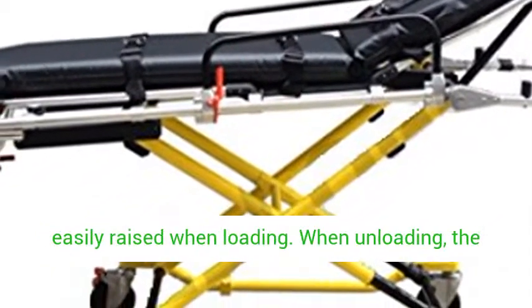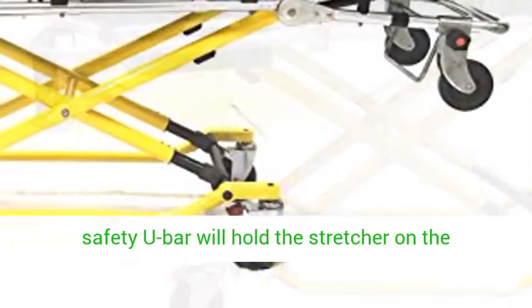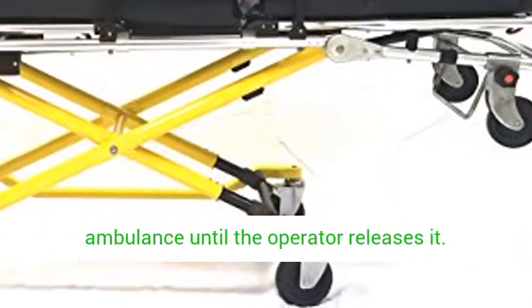The X-Frame undercarriage is easily raised when loading. When unloading, the safety U-bar will hold the stretcher on the ambulance until the operator releases it.